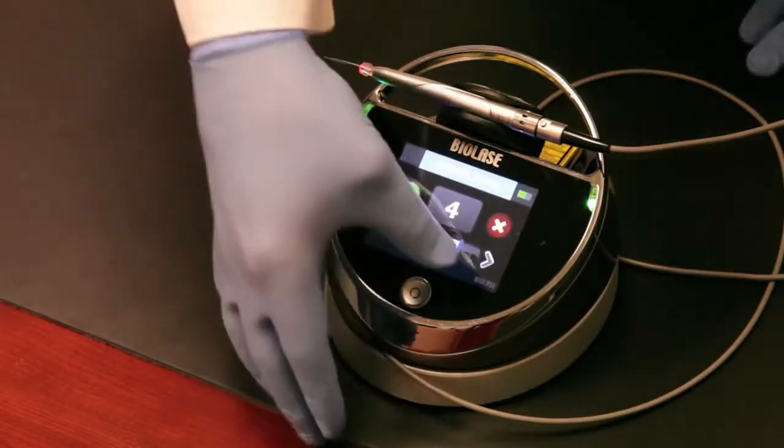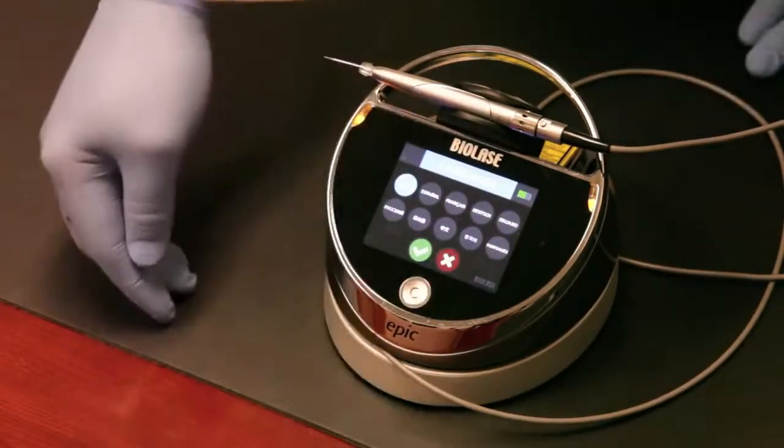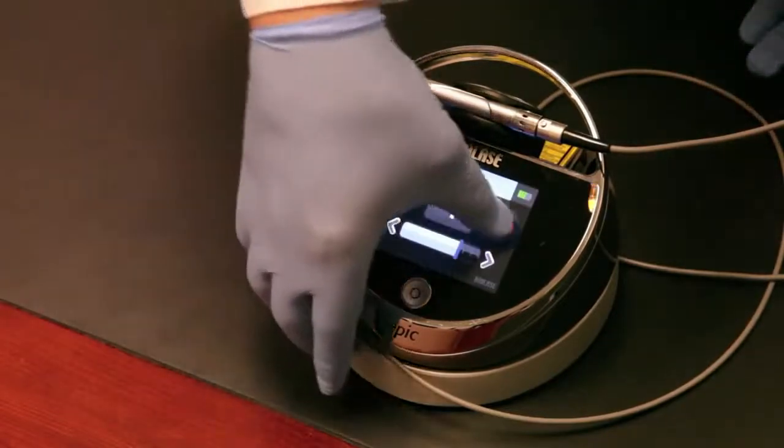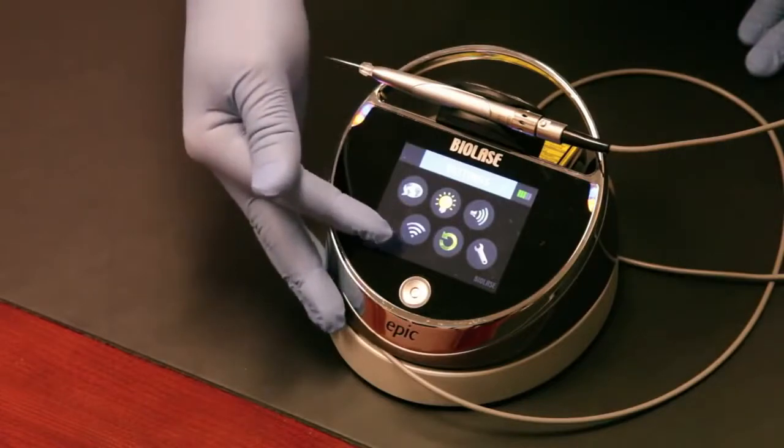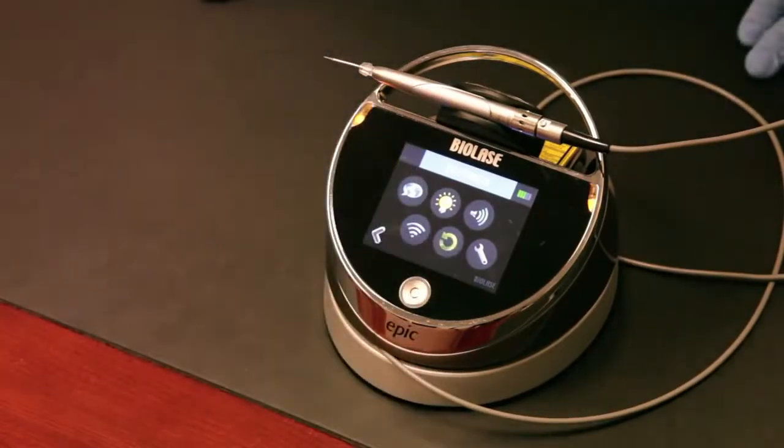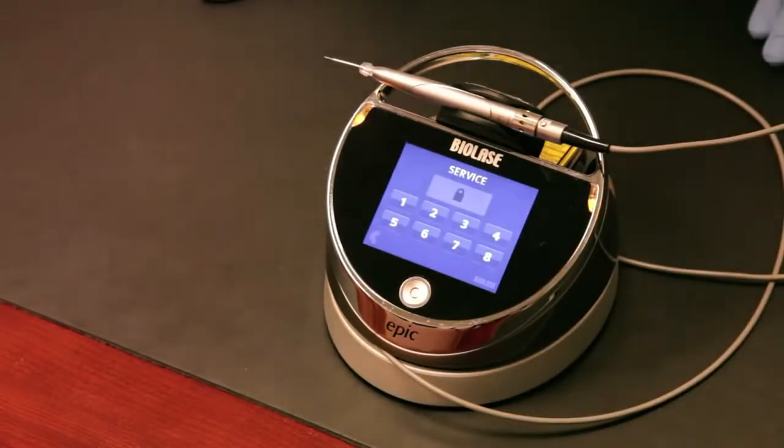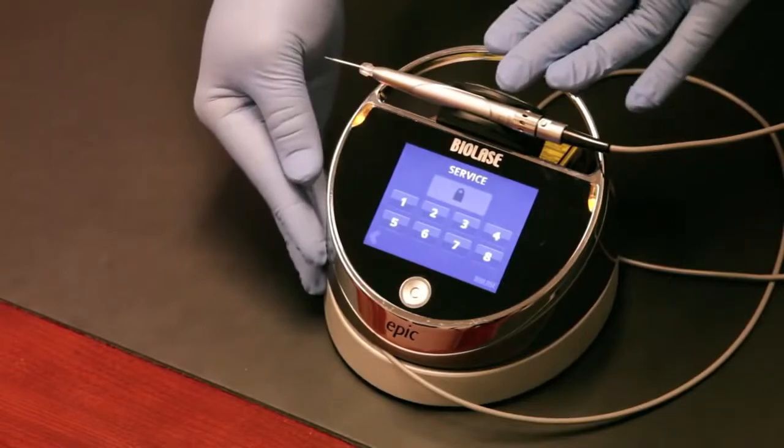You can adjust the aiming beam brightness, adjust the language that you're using. You can see all the preloaded languages there. You can also adjust the volume of the unit itself. Then there's a couple of other settings related to the wireless Bluetooth foot pedal and of course a screen that our service technicians can get to if they need to perform laser service on your Epic. That's buttonology, that's how the laser works from the user interface perspective.